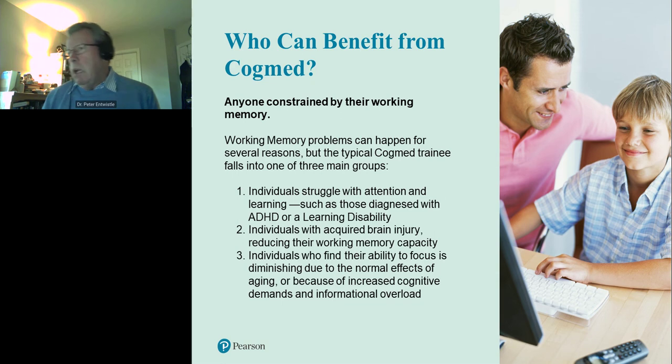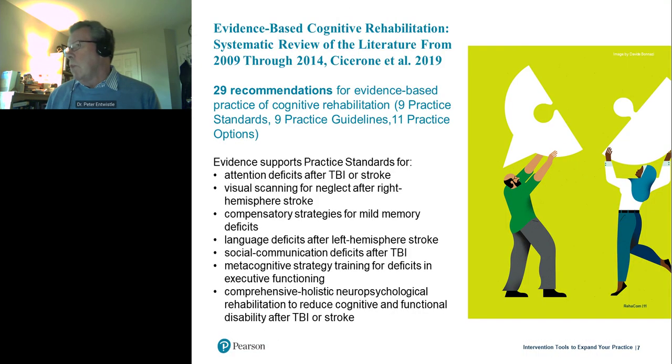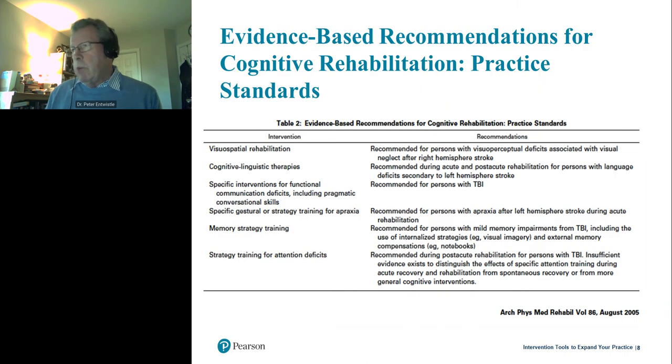Now, in addition to that, it may be important to enhance the functioning of individuals that have sustained a brain injury, or as Anne-Marie said, perhaps they have working memory problems because of stroke or perhaps a degenerative disorder. So it is essentially a program that can help individuals focus. And what you will find is that as demands increase and individuals experience what Klingberg refers to as information overload, you really need to be able to enhance your working memory to compensate. One of his books was called The Overstimulated Brain.